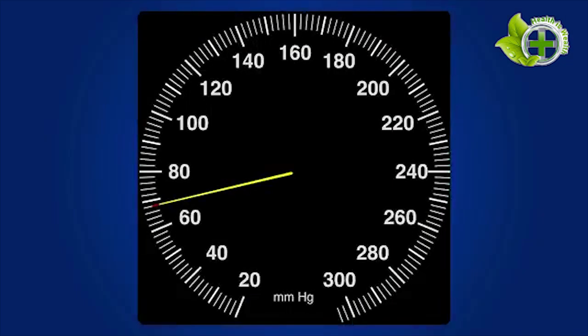Now let's use the needle to determine the number displayed on the dial. Concentrate on the tip of the needle and the line that it's pointing to. How much does this line represent? If you stated 68, you are correct.